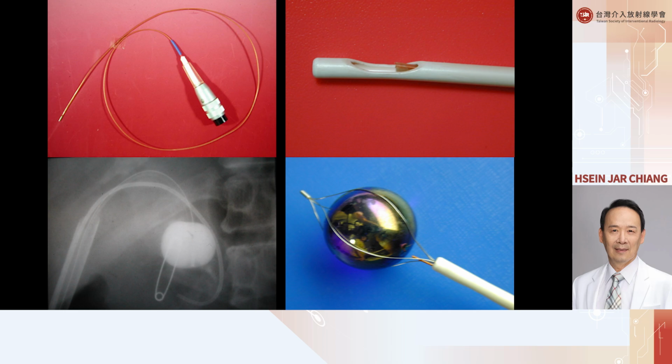At first, I used the Foley catheter as a guide to put the EHL probe into the common bile duct, but the Foley catheter is very soft and very difficult to control. So I designed a special catheter for the EHL probe. The catheter has one side hole facing the stone, so the probe can hit the stone much more easily. The other advantage is that we can catch the stone with a basket, so the probe can directly hit the stone. So this is a very good way to crush the common bile duct stone.